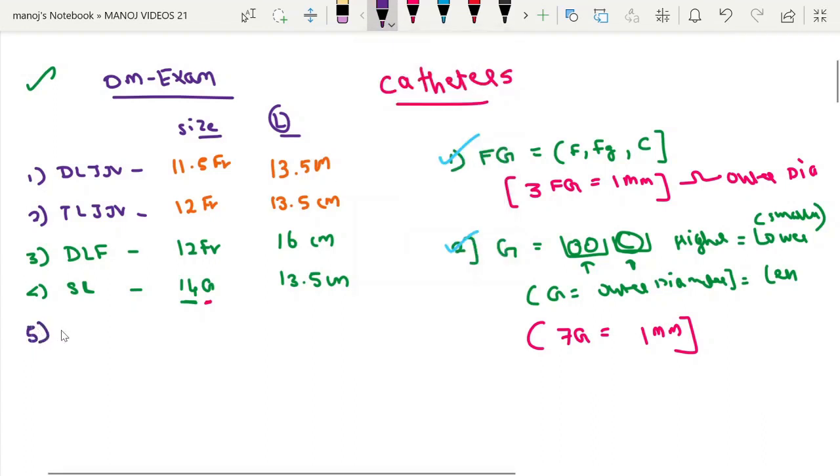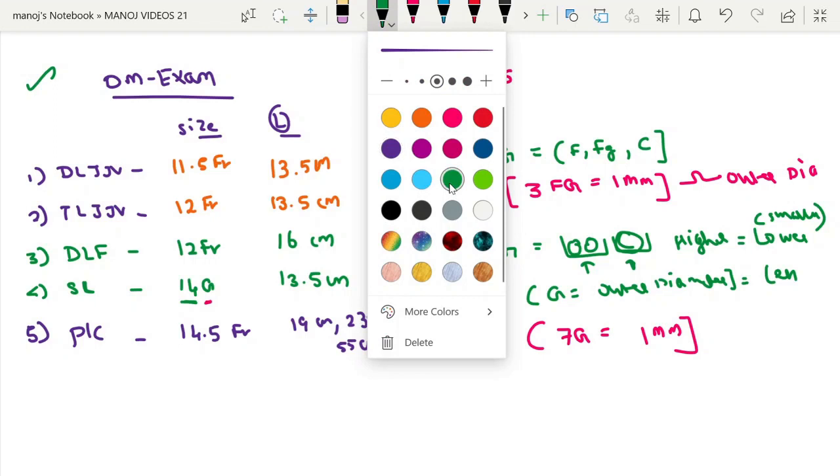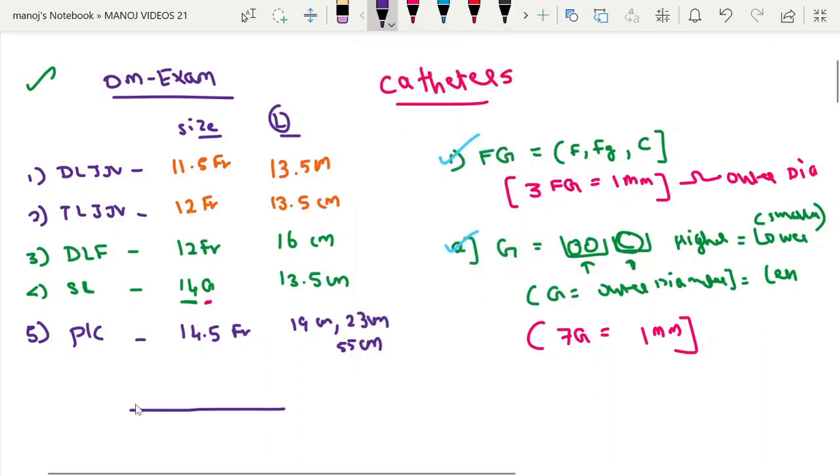The next is the subcutaneous tunnel catheter which is called as permacath. Size is 14.5 French and the length varies. There are 3 lengths: 19 cm, 23 cm, and 55 cm which is being used for the femoral catheterization. With respect to this perm cath, the perm cath will be like this. There will be a subcutaneous cuff over here, another catheter, the port and the hub.